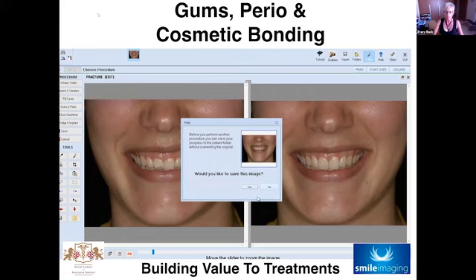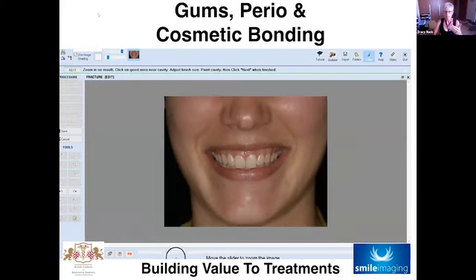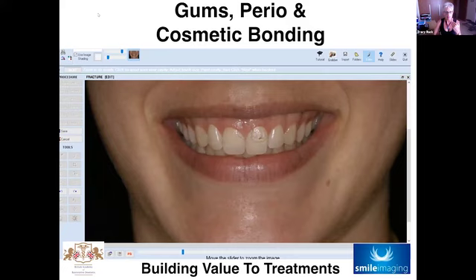And then finally, we're going to use the fill cavity tool. So this was the one that we used for the facial aesthetics, smoothing of the lines. This obviously we're going to do the teeth. So clicking on a piece of tooth colour that you like, it picks up that colour, and you can then adjust how dark it is, and you can smooth out the colour and smooth out the lines.